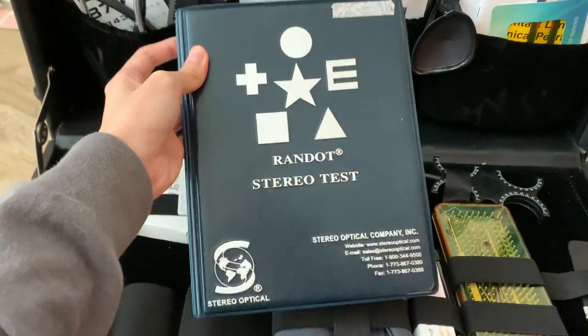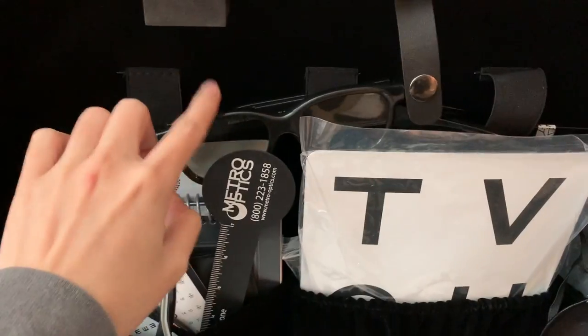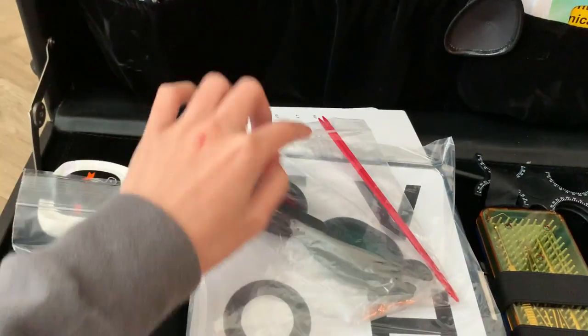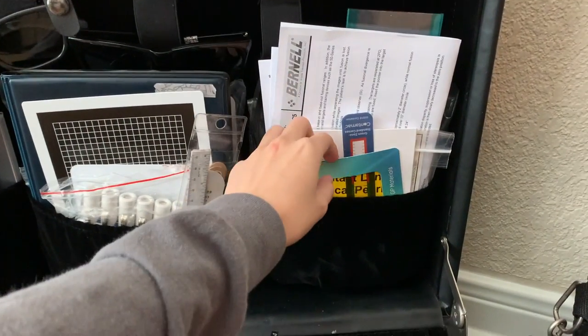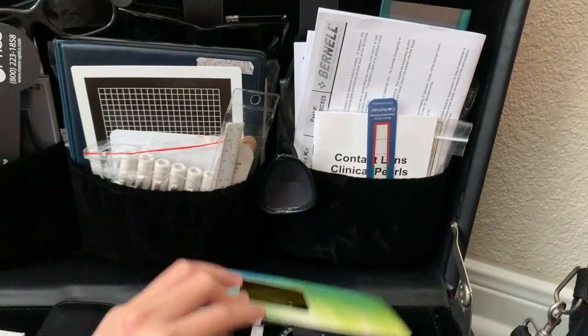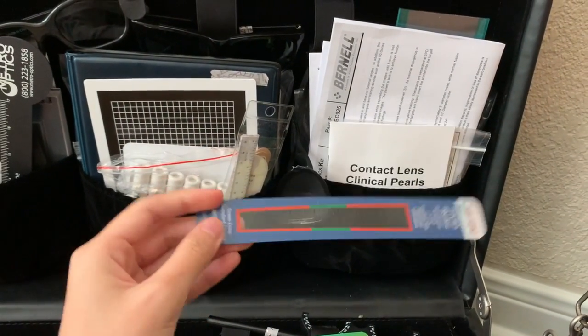This is the Randot stereo test — it checks to see how well your eyes work together and whether you can see in stereo — and you use these 3D glasses to go with it. Here's an HOTV chart. Here we have red-green glasses and a little stick for when we're doing vision therapy. Here's a red filter that we use for the slit lamp to get a better view of the anterior segment, and our HVID ruler.